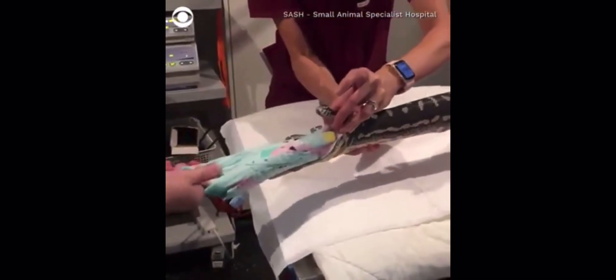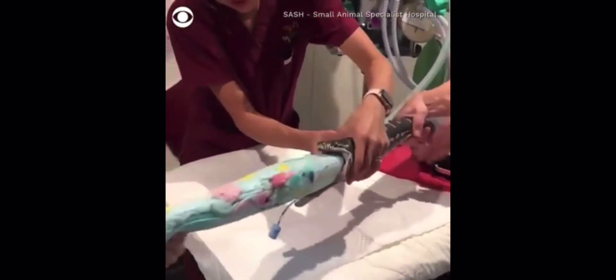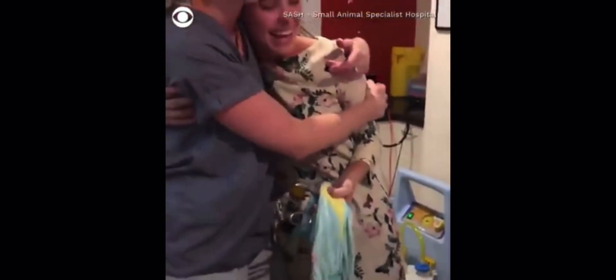Don't pull the tube. Oh my god. Oh my god, oh my god. Yay! Good job! Thank you! That's huge! Oh my god!